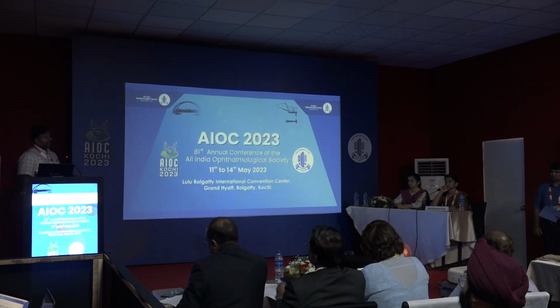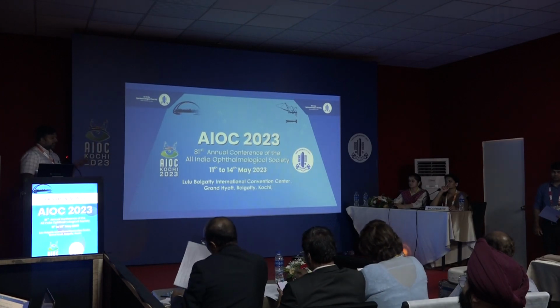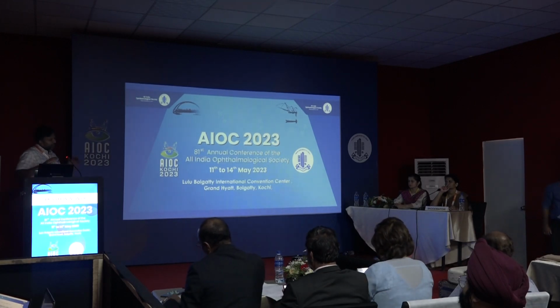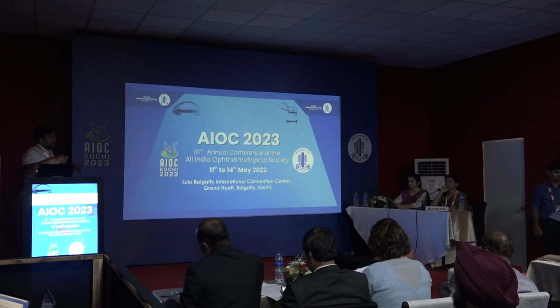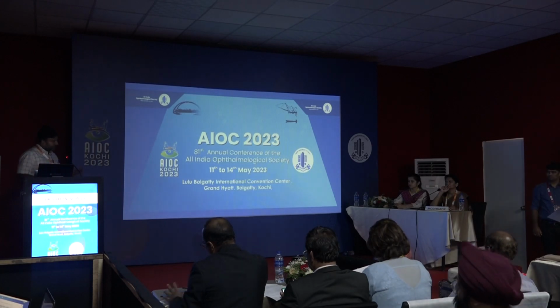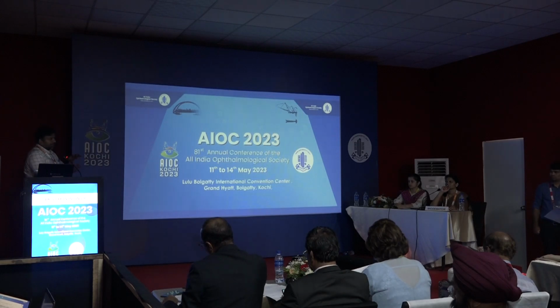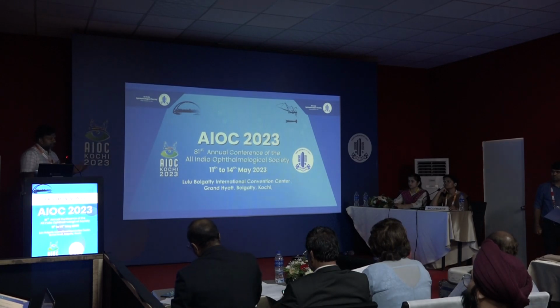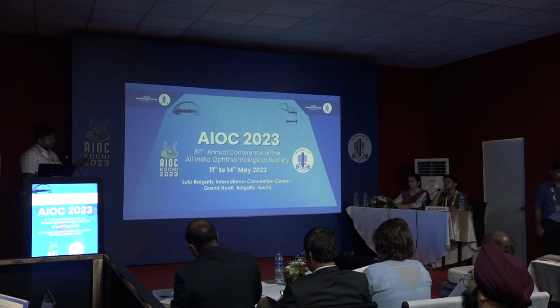Yes. So intraoperatively, initially we had cases where there was tilting on one side. The other point is we are placing the IOL 0.5 diopters higher than usual. After positioning the IOL inside, both the sutures coming out of the sclerotomy are stretched, sir. When it pulls, the flange inside the eye, which is plugging the IOL, will automatically plug the sclerotomy holes, and then it stays there. I do not know the explanation, but when we stretch, it comes to a position and it stays there. That stretching part is very important to keep a flat IOL without tilting at the end.